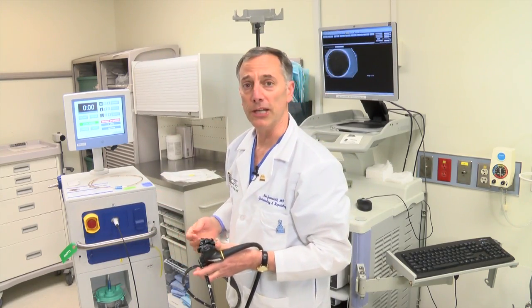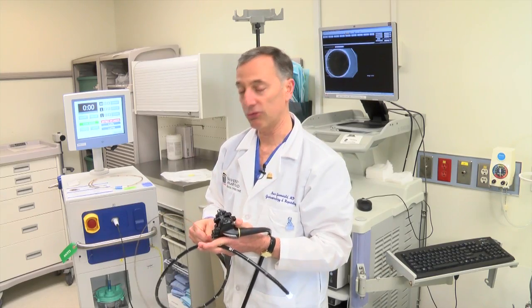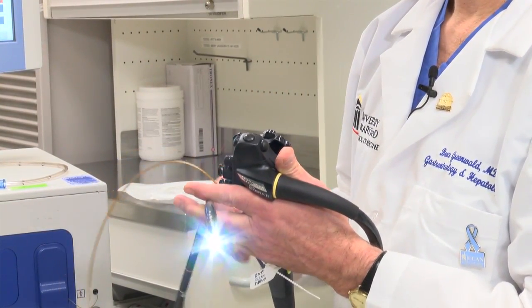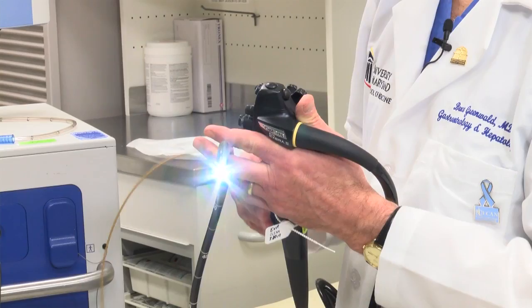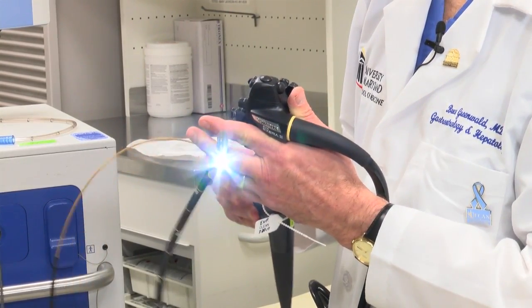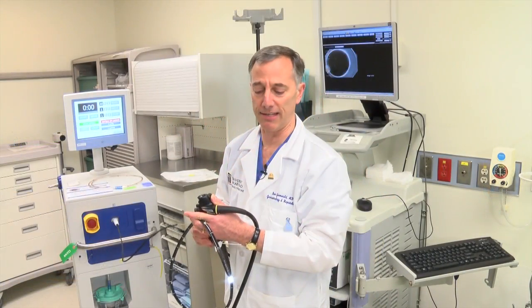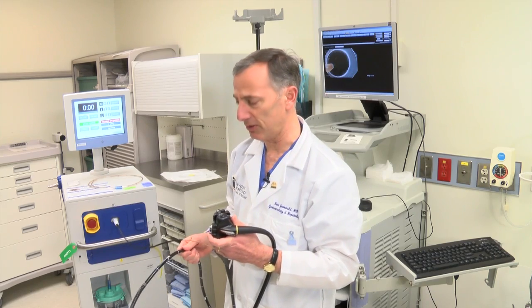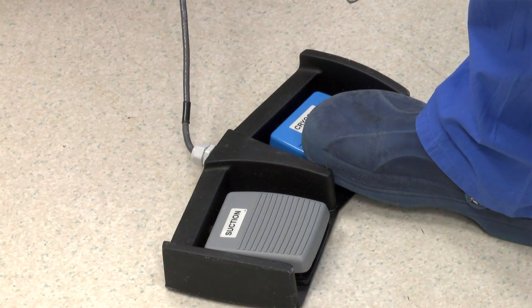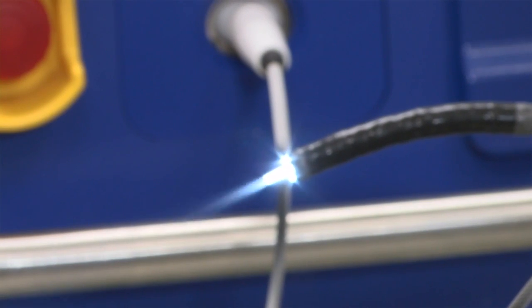To perform liquid nitrogen spray cryotherapy, we take the catheter and insert it through the working channel of a standard upper endoscope. Typically, I will use a distal end attachment to aid in the cryotherapy treatment, and we'll insert this until the catheter is just barely extending past the tip of the scope. When we're ready to spray, we'll initiate suction first, while a nurse is monitoring suction in the patient. Next, we'll press on the spray cryotherapy, and you'll see that as the catheter cools, liquid nitrogen will exit the tip of the catheter.